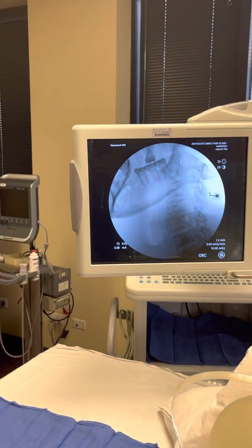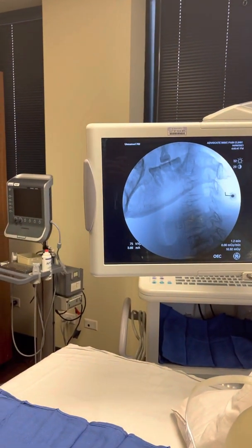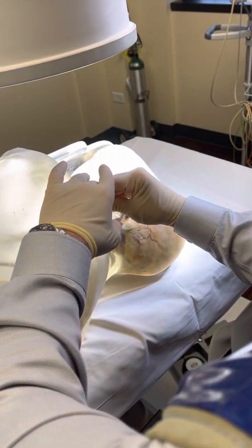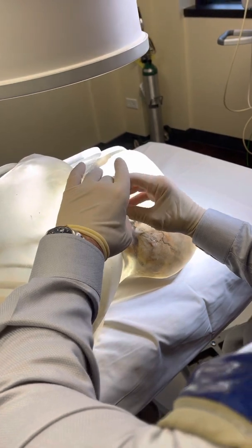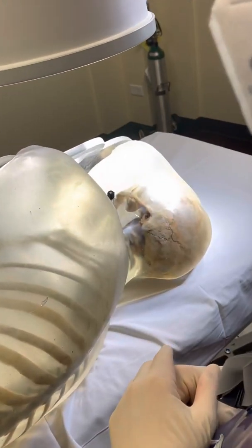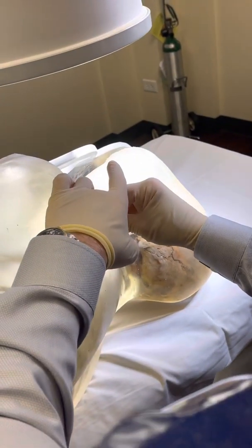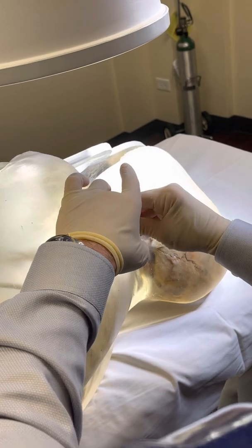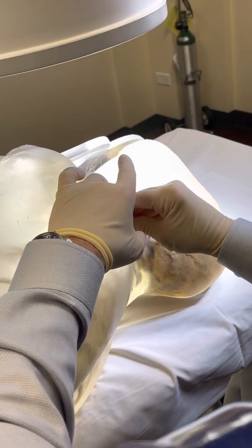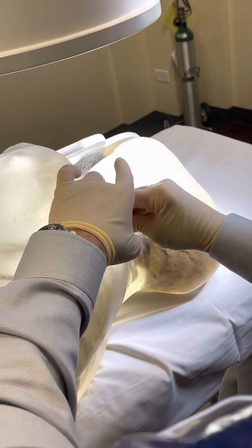Here I'm a little too posterior still, so I'm going to be moving slightly anteriorly, with the goal to place the needle into the cephalad and dorsal part of the neural foramen.